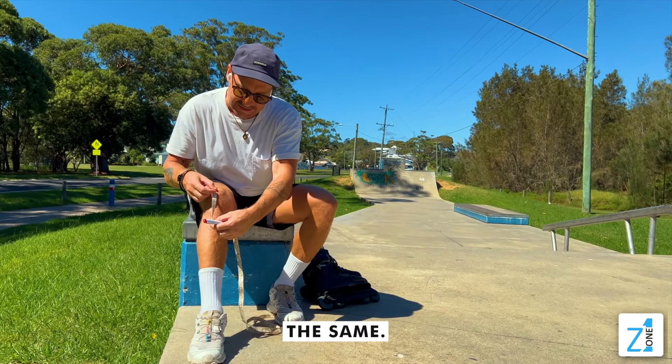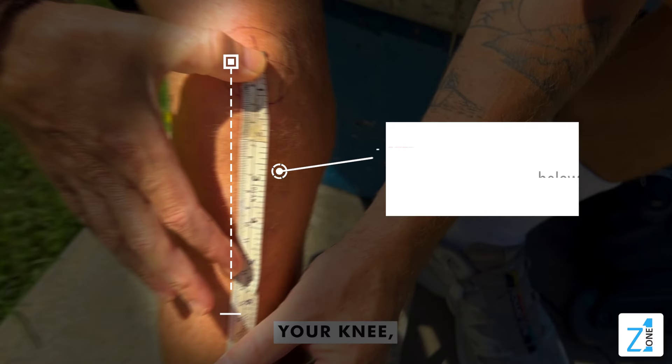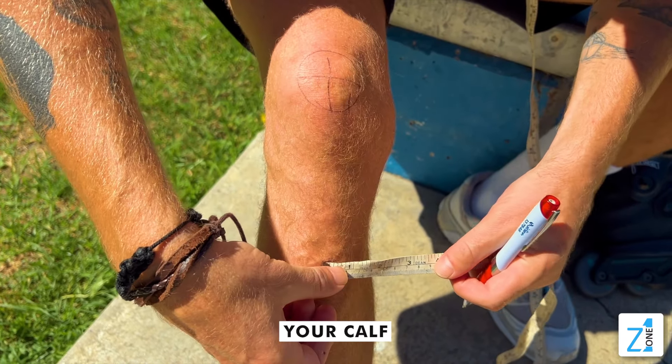Once you've done that, you'll do exactly the same — line it up onto the front of your knee, mark six inches going down, and then do the same circumference measurement around your calf.